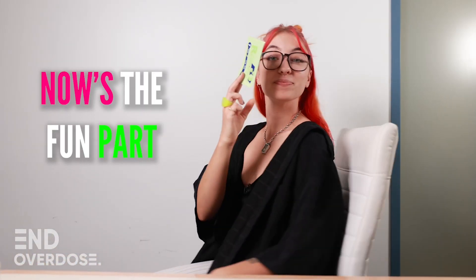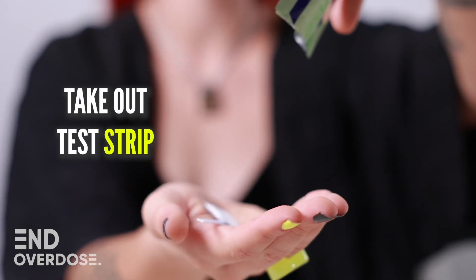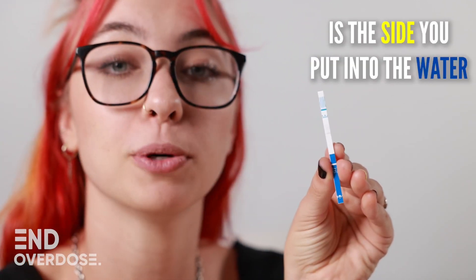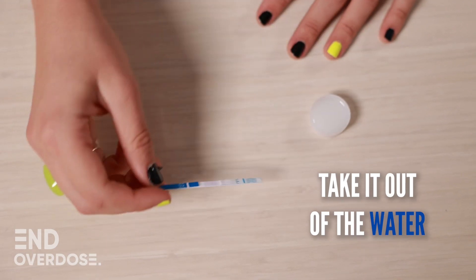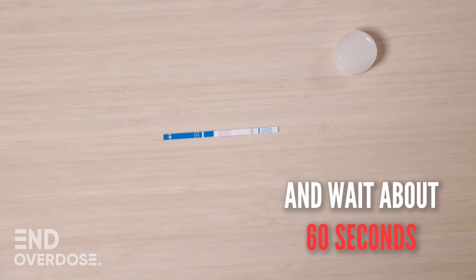Now's the fun part. Open up your package and take out your test strip. The side with the little blue triangles is the side you're going to put into the water. Dip the strip into the water for at least 10 seconds. Take it out of the water and wait about 60 seconds.